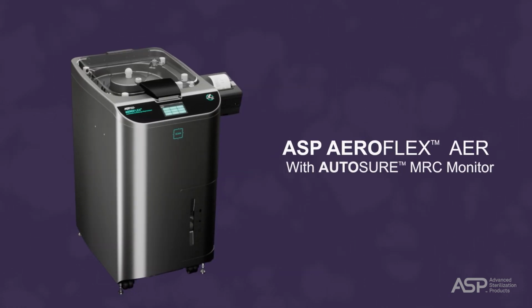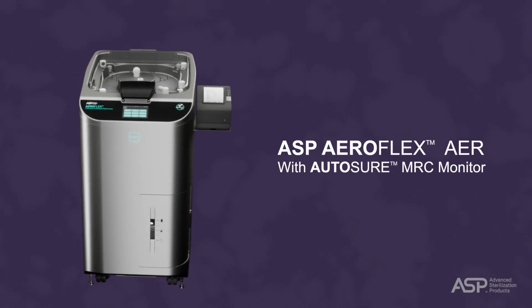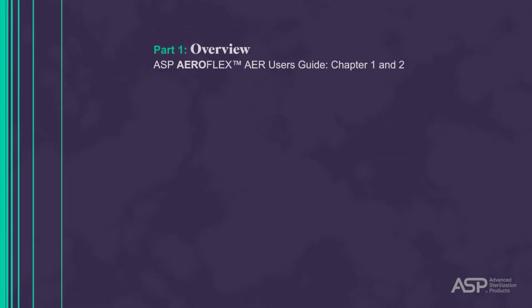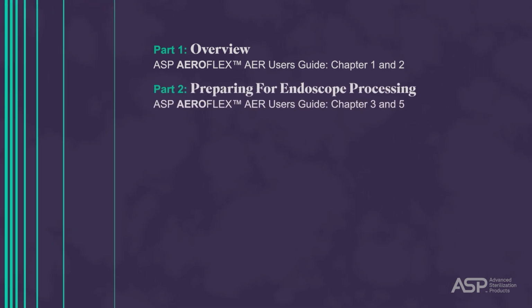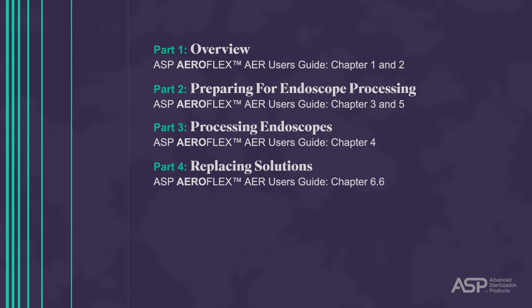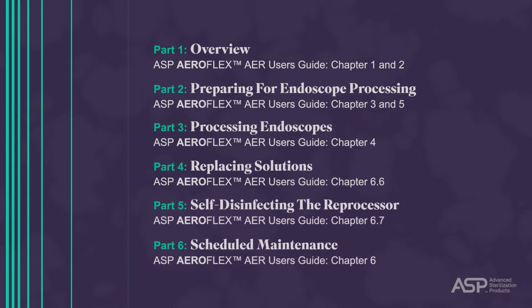This video will present important information about operating and maintaining the ASP AEROFLEX AER with AutoSure MRC monitor, including an overview of safety, setup, and cycle information, preparing for endoscope processing, processing endoscopes, replacing solutions, self-disinfecting the reprocessor, and scheduled maintenance. For full instructions on the ASP AEROFLEX AER, please refer to the user's guide.